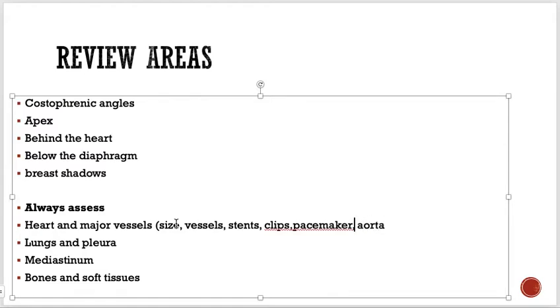So of course, like I told you, I'm going to talk about the basic things. So these are the most basic things in lungs and pleura. Remember, we can also appreciate many things, like you can check for the size of the lungs, any pathology you can see in the lungs, any lung markings you can see, right?